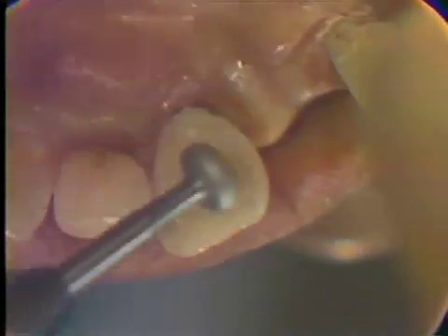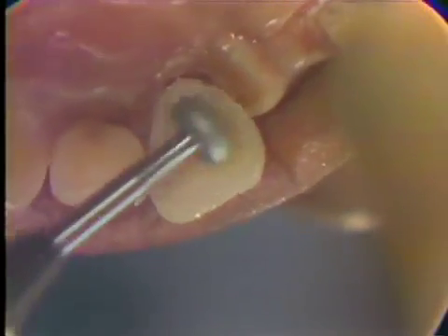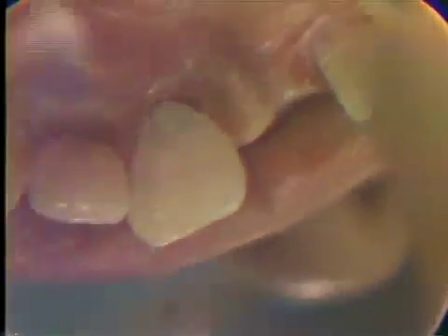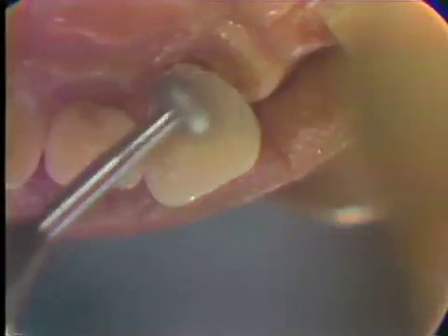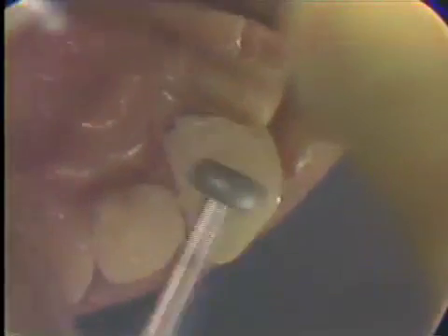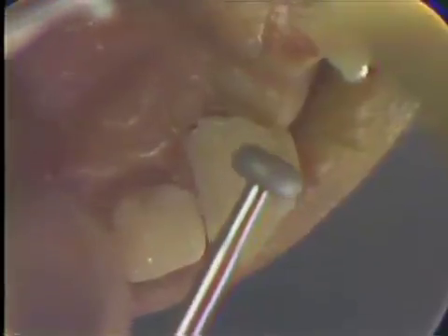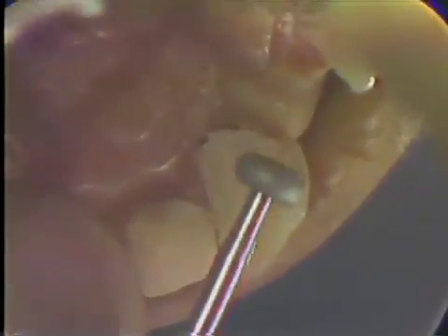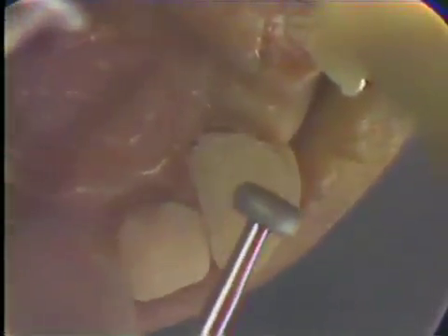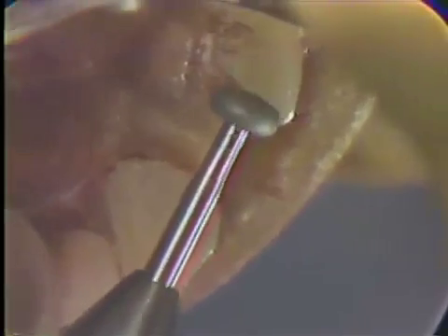Now we're going to make any necessary adjustments in clearance with a biscuit diamond. There are a couple of areas we want to smooth up — just round this a bit. In the area where your incisal bevel comes into your slice, you want to make sure that there's enough gold there, so you round that slightly. Here we're doing it direct on the mesial of the lateral incisor.